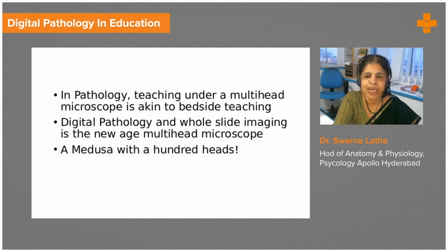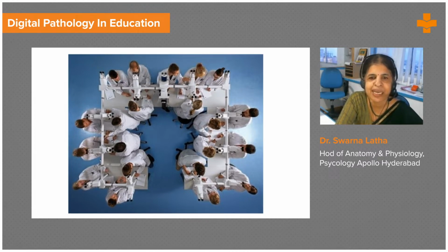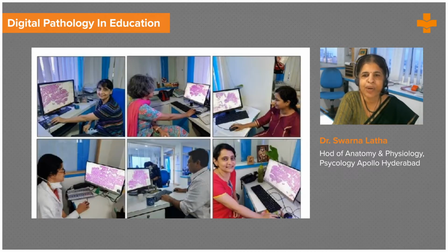So if you look at the classic multi-head microscope, and this is a very, very sophisticated one, not many of us have even seen such a microscope. It has 20 people sitting all huddled together, definitely a no-no during this COVID season, seeing the same slide and being taught together. But you have to remember that they have to be physically present at one place for this teaching to occur. Now, what happens in the digital microscope is quite the opposite.